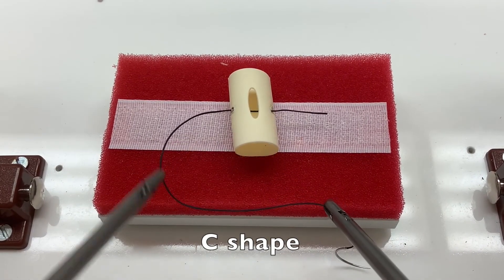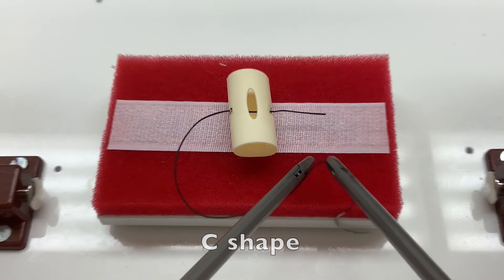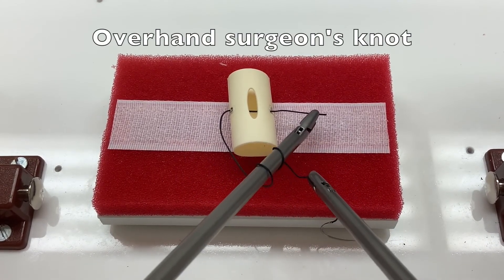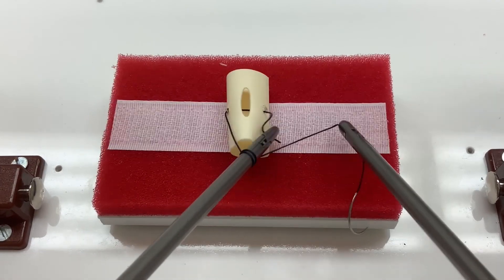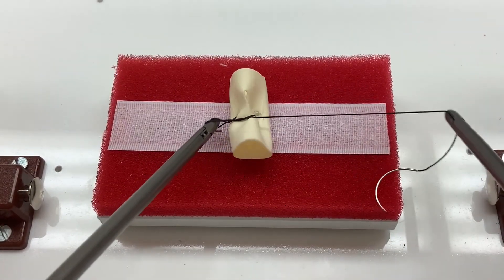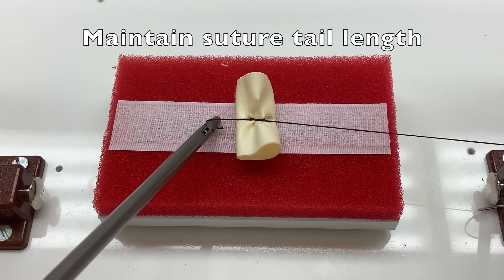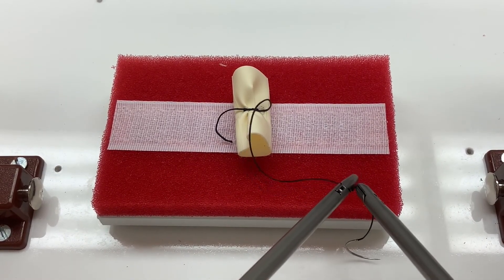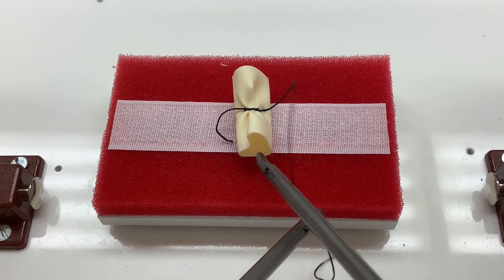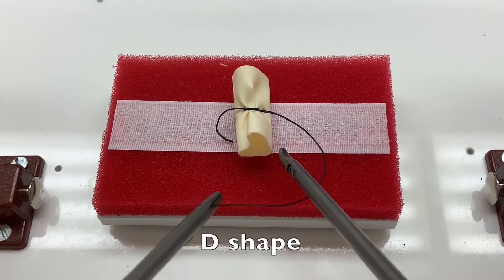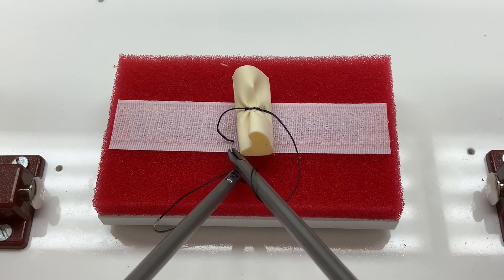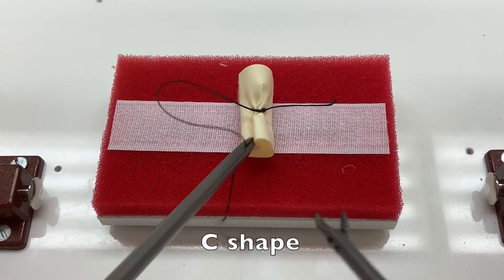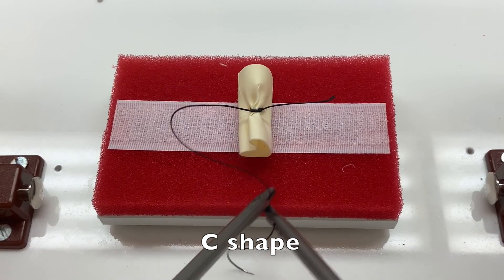The right hand grasps the needle end of the suture 1-2cm from the needle. When securing the knot, maintain the length of the suture tail. Transfer the needle end of the suture and position the suture in a D shape. Repeat this process once more with the suture in a C shape.